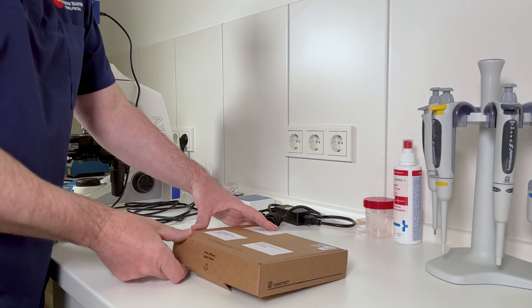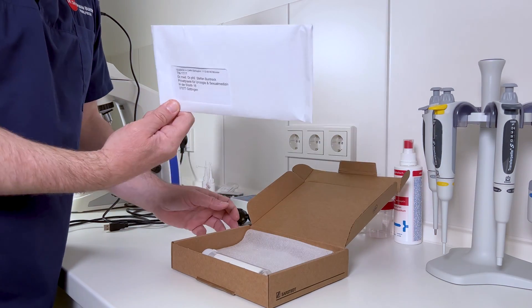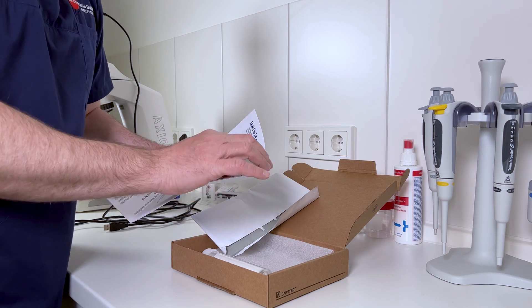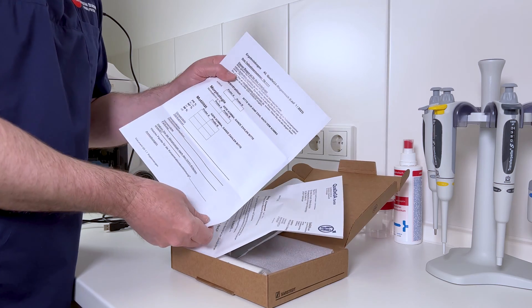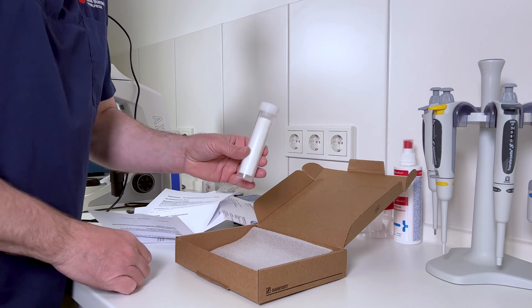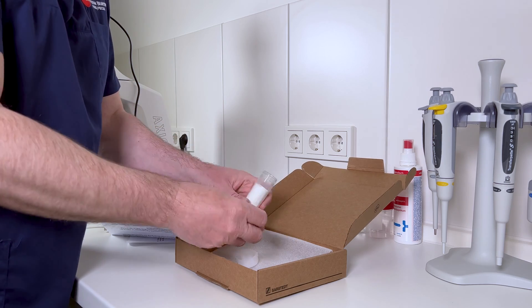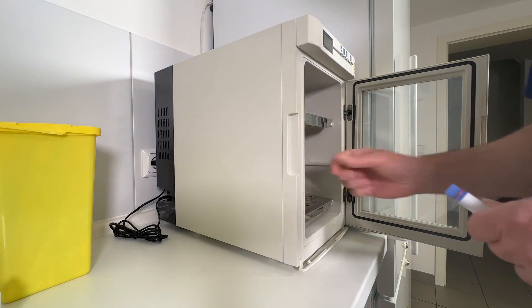Let me unbox this thing. Here's a letter with the instructions — it's from the lab, and I usually also get a sheet where I can write in my results. And this is the sperm. It's in two small samples that I have to heat up before processing.